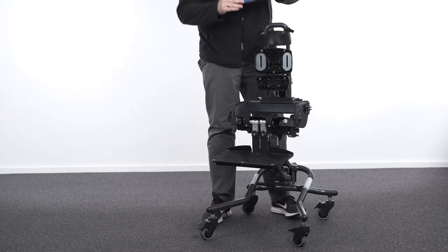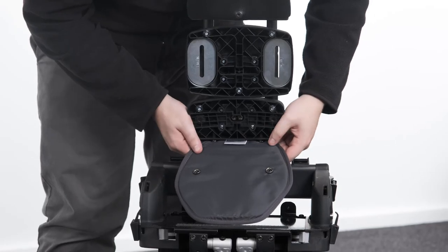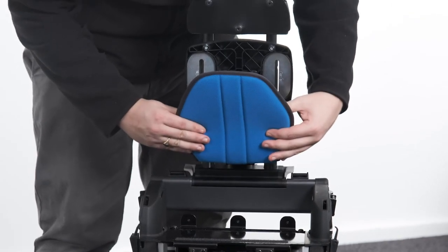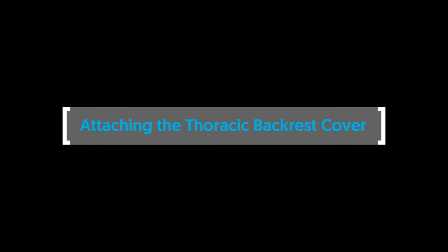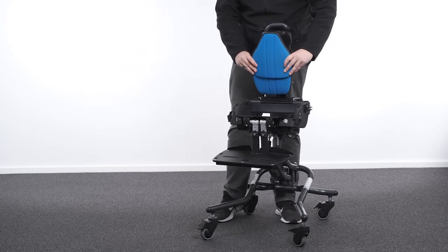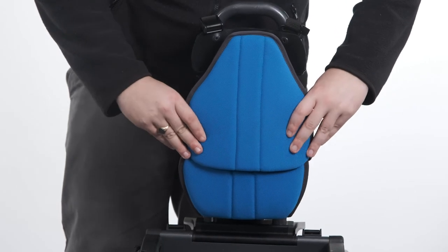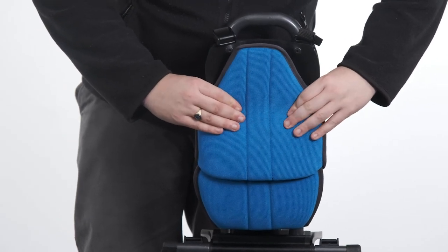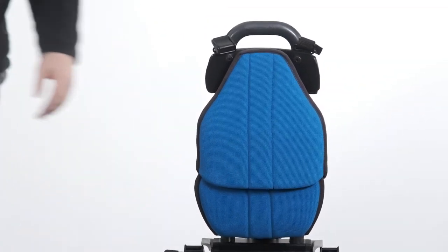Attaching the sacral cover. To attach the sacral cover, align the cover with the moulding and secure in place with the snap fasteners at the sides and underneath the moulding. Attaching the thoracic backrest cover. To attach the thoracic cover, slot the top of the sacral cover into the cavity on the underside of the thoracic cover. Align the thoracic cover with the moulding and secure in place with the snap fasteners at the top and bottom.